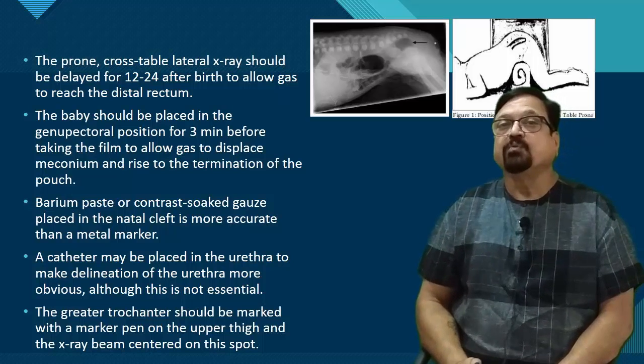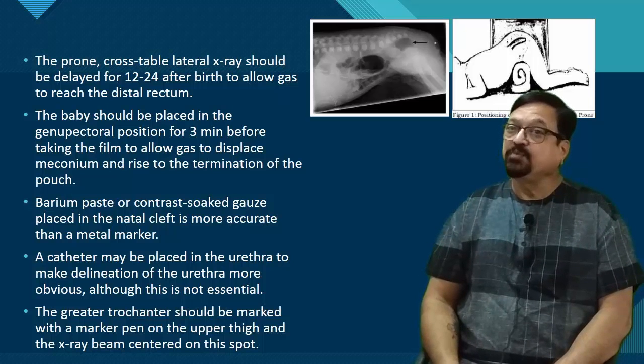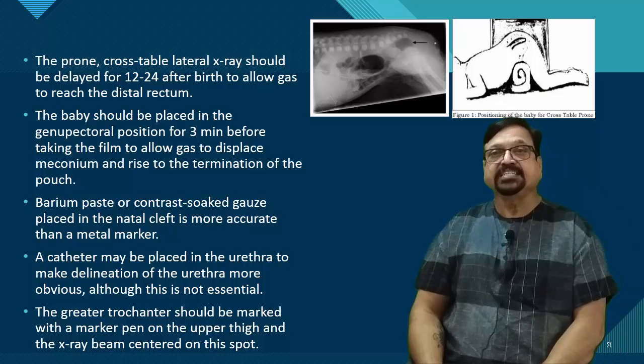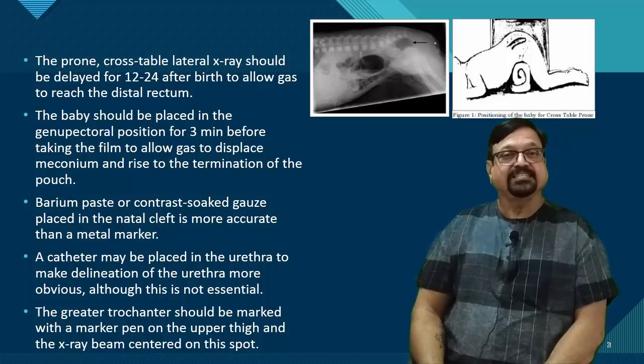Now more details of all these procedures, particularly the invertogram, are covered in some other lecture series. In that we have the advantages of invertogram over the cross table lateral. However, this technique is comfortable for the patients, that is the babies, and therefore at many centers it is adopted, and invertogram is technically difficult.